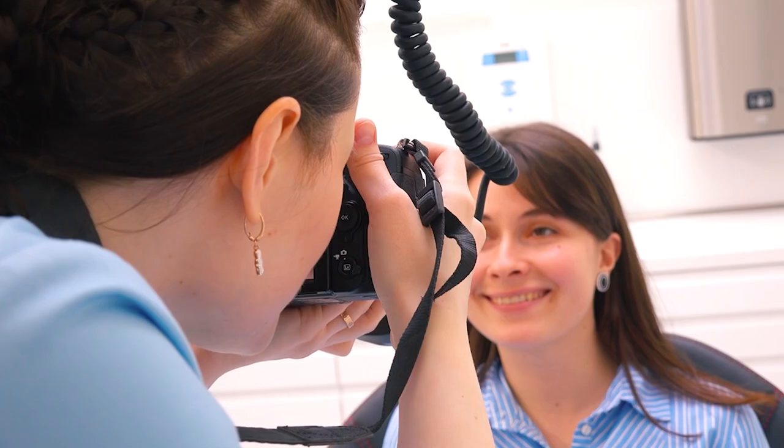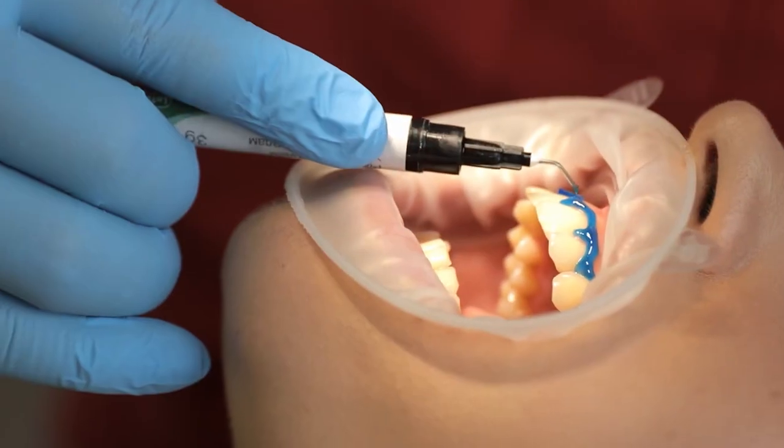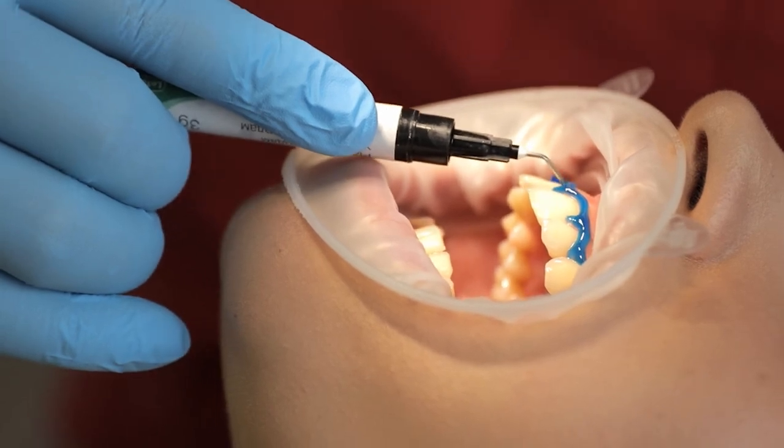The patient comes in, we take pictures and we take the initial shade to make sure we know the color that we started with. Then we proceed to protect the tissues and retract the lips, making sure that we protect the gum before placing a gel that is going to do the function of whitening the teeth.